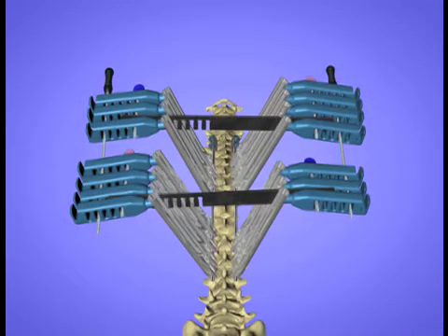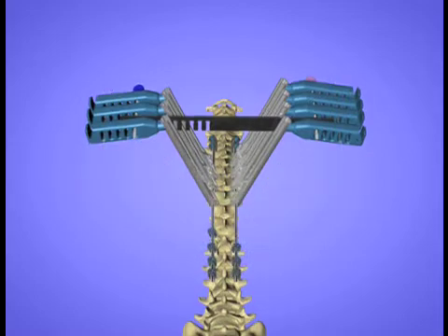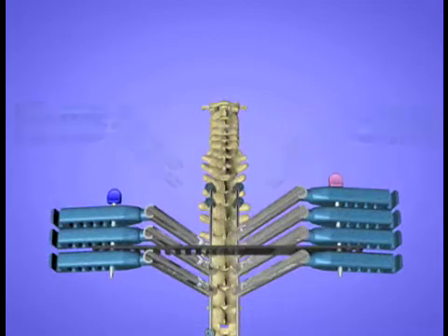Once the principal major curves have been addressed, attention is turned to the cephalad foundation. The thoracolumbar cluster instruments are removed, and the derotators are set up and linked on the upper foundation.